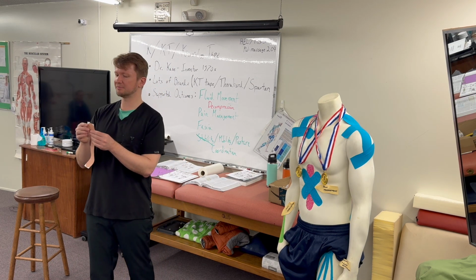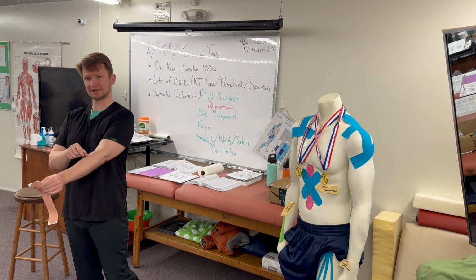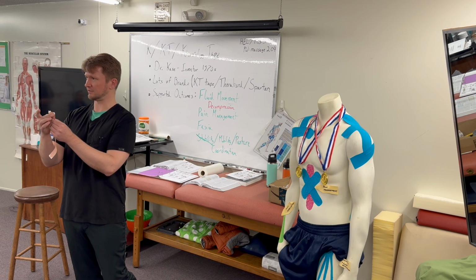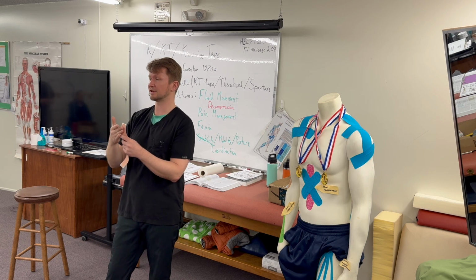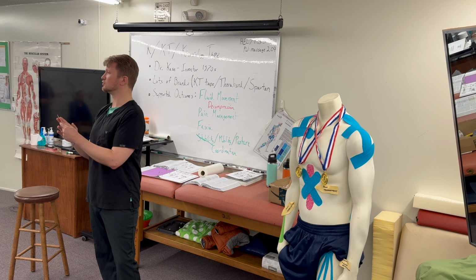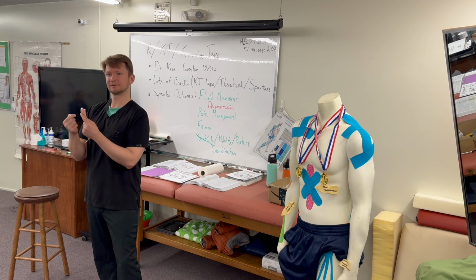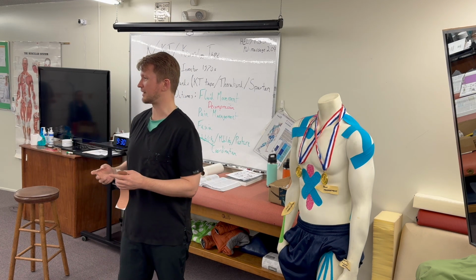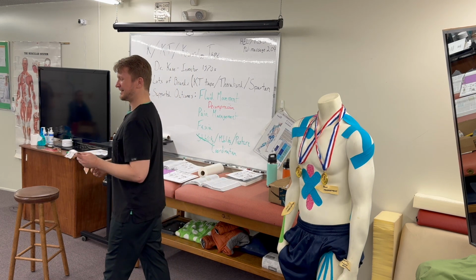All that's really about is that a sharp corner can get caught and roll up and lift more. So when you see people bothering to do this, it's because if you get these on big rolls that are not pre-cut, you have to cut them yourself to size. And then what's usually shown is to round the corners. So you bring out your good old arts and crafts days and just make snowflakes.